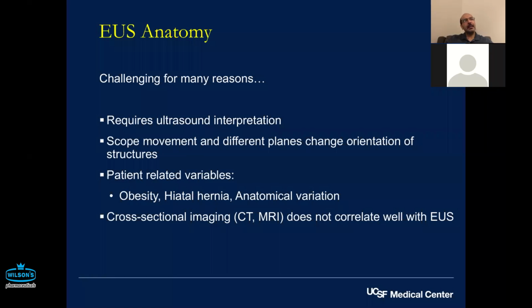As I have evolved my own learning over time, I think that is true, though I will say that trying to understand the anatomy somewhat going into it is generally a much more educational experience, in my experience, than going in completely blind and just memorizing images. I think it has to go hand in hand. Some of it just has to be done. You have to do like 50, 100 EUSs to try and understand how things work.